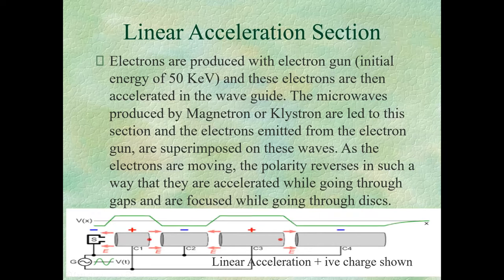And then we have physical wedges, which usually come in a combination of 15, 30, 45, and 60 degrees. Those are physical wedges that we have in the accelerator room, and we can attach them at the end of the head, where there is a slot in the machines. So if you want to treat with those wedges, we attach them in the slot. So these are three different kinds of wedges that you may come across when you are talking about accelerators: universal wedges, enhanced dynamic wedges, and physical wedges.